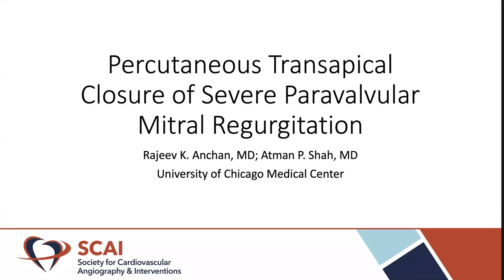My name is Rajiv, and I'm one of the interventional fellows at the University of Chicago Medical Center. My mentor for this case is Dr. Atman Shah, and I'll be discussing a case of percutaneous transapical closure of severe paravalvular mitral regurgitation.